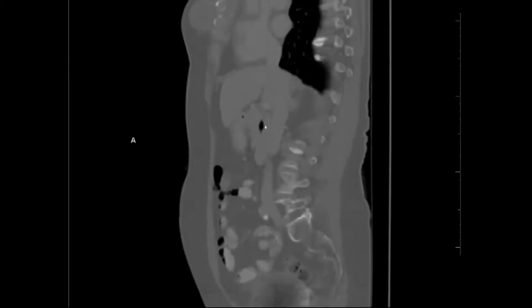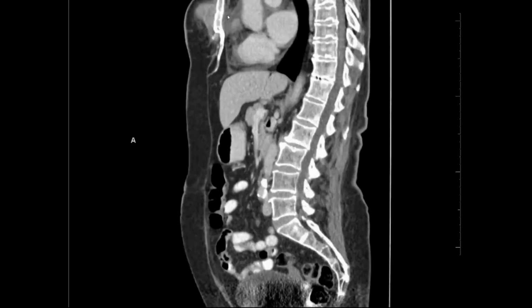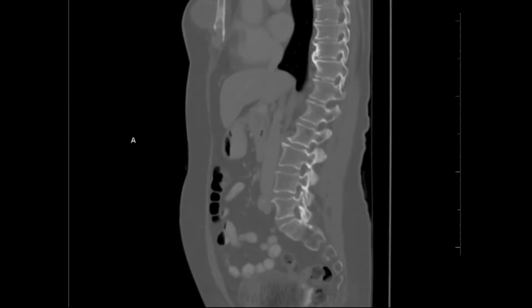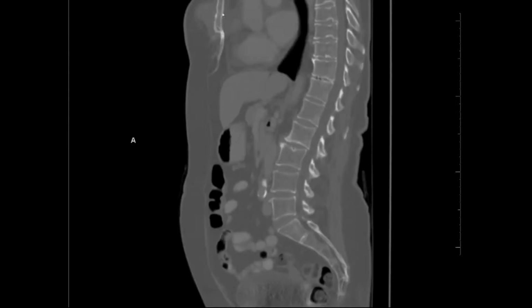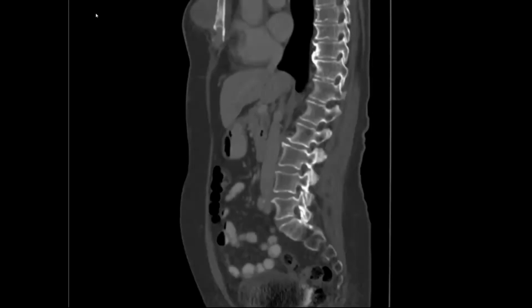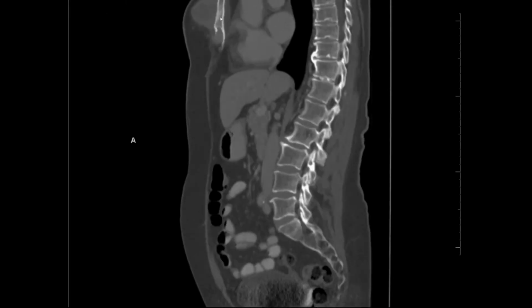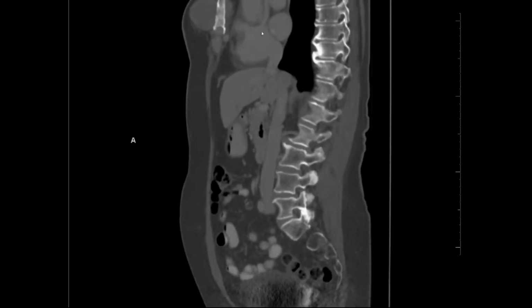Bones, to me, the quick run view that I look at is I try to look at everything straight, and it's kind of challenging to do that regarding ribs, but I've figured out the method that works for me. Sternum is, first of all, on the sagittal view here. The spine you can see so well, and so that's where I always go when reviewing spine. The sternum is also one of those hidden bones that not a lot of people look at. A lot of residents miss that, but you can see here that this is actually just straight up invading it, and that could be confirmed later as you lose the cortex anteriorly.